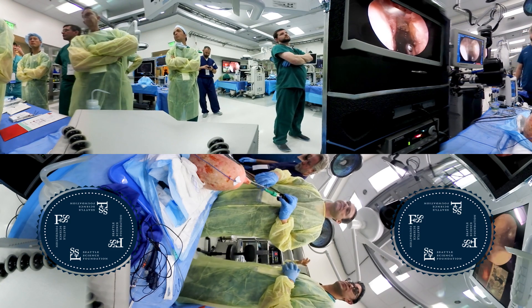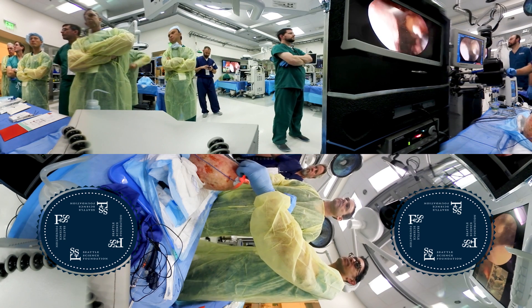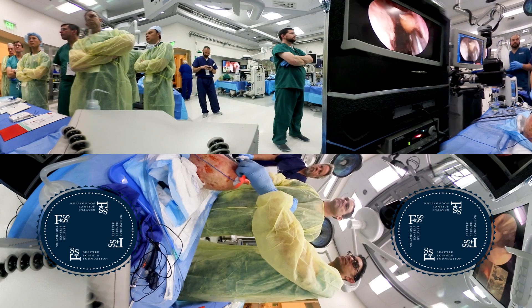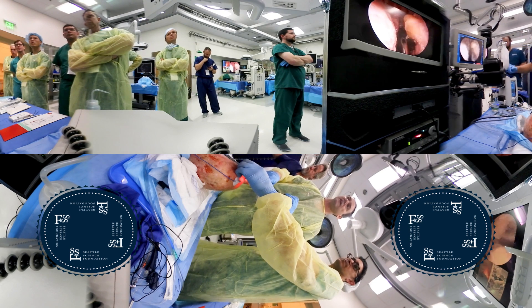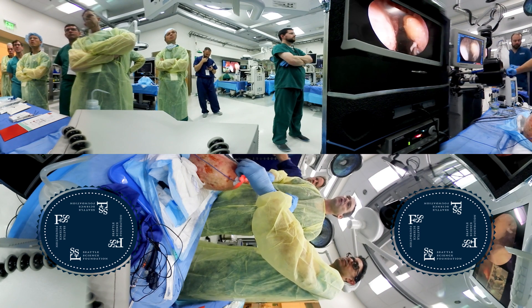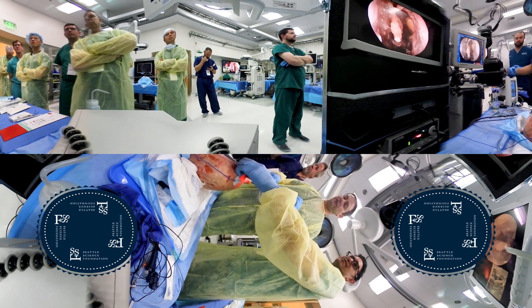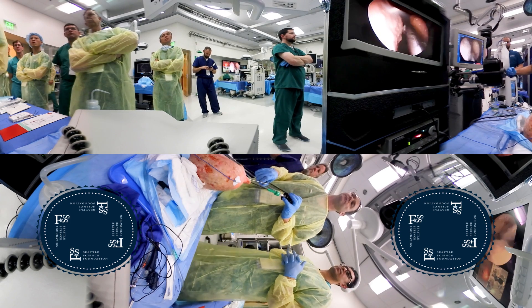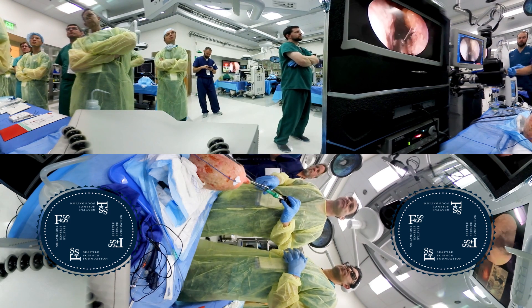We go into the sphenoid — not talking about an optic nerve decompression, just an orbital decompression — just until you've identified the fibrous annulus. Once you've identified and released the fibrous annulus, that releases all the pressure in the orbital apex. After that, I used a sickle knife to go through a little bit of the fat to help break down the fibrous connections, then pulled off the rest of the periorbit. Dr. Marty is now palpating the eye — retropulsing. You may think you won't treat thyroid eye disease, but you could get an abscess or hematoma in the orbit, and this is a great way to decompress it.